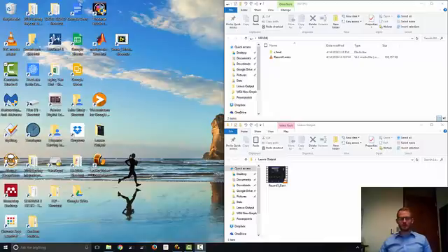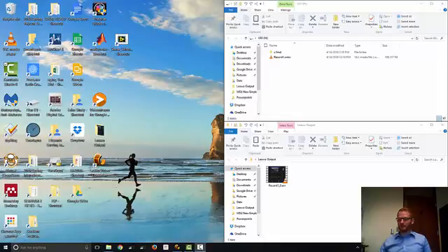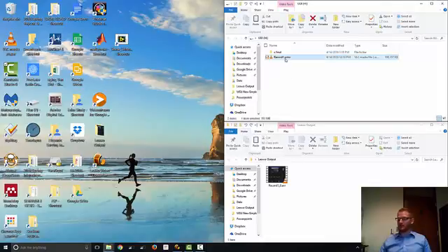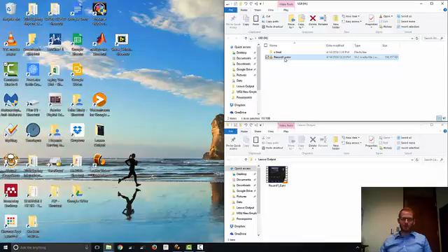Okay, so I'm going to try in this video to show you how to analyze an ultrasound video that's been captured for the purpose of doing a flow-mediated dilation test or another test that requires both Doppler and a constant measurement of the diameter of the vessel. We're going to take this video file here that was recorded in LabChart Pro using the PowerLab hardware, and this is of a brachial artery during an FMD test.